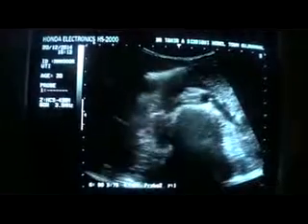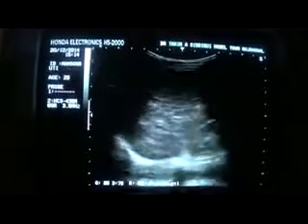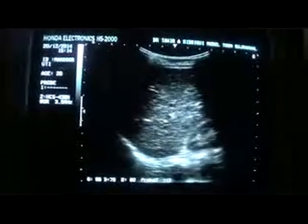This is an ultrasound study of a patient aged 20 years, referred with the history of pyuria, painless, for the last few months, not responding to any antibiotic whatsoever. Now the picture in front of you shows, first of all, if we concentrate on the liver, that the liver shows diffuse decreased parenchymal echogenicity to the extent that the minor portal vein radicals are so prominent.